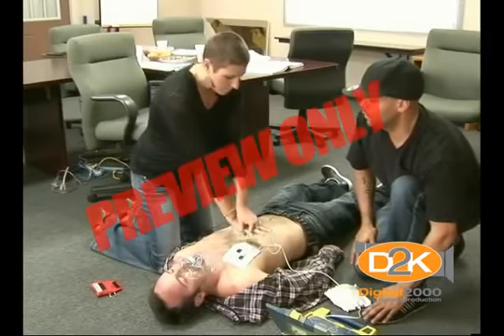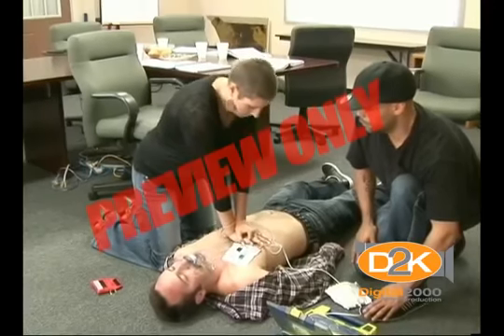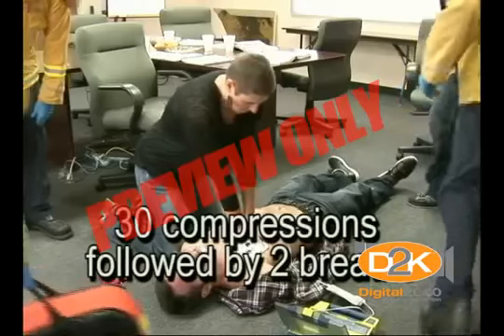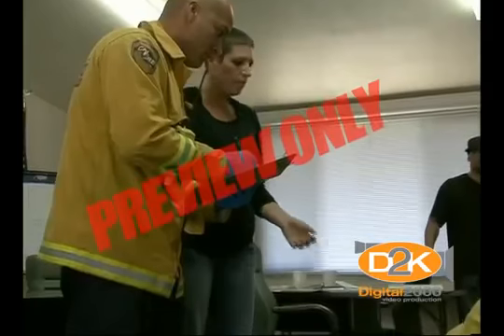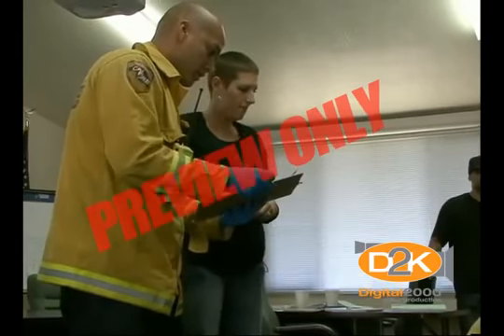Start CPR. Give 30 compressions, then give 2 breaths. Continue to perform 30 compressions followed by 2 breaths until EMS arrives, an AED arrives, or the victim shows signs of life. Once an AED arrives, immediately place it into operation.